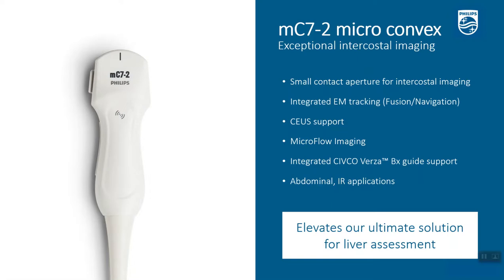The MC72's superb imaging qualities are complemented with contrast enhanced ultrasound capabilities and microflow imaging. This transducer is also compatible with the Civco Versa biopsy guide. You can attach this guide directly on the transducer without an external bracket, and this helps to reduce the blind zone during needle guidance.